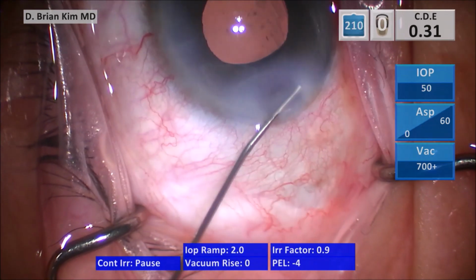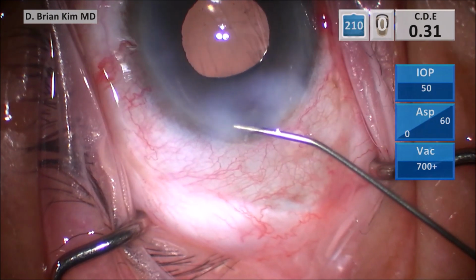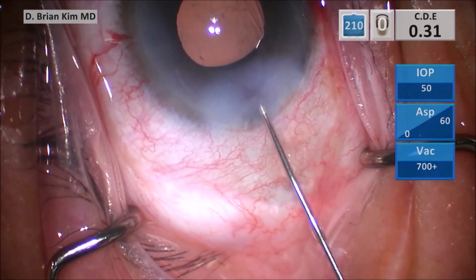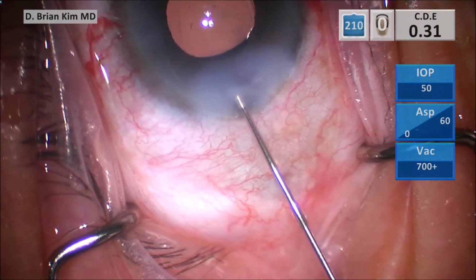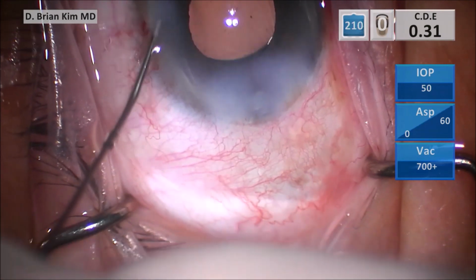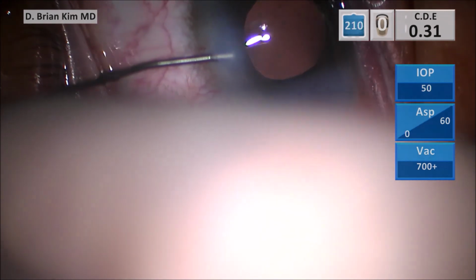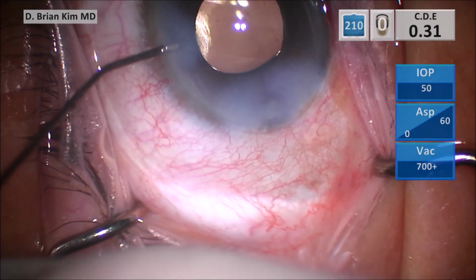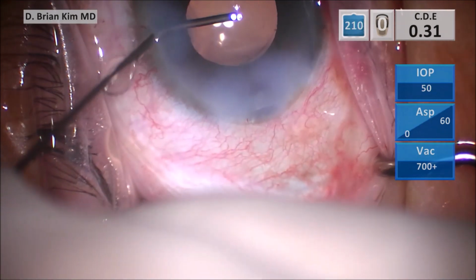So again, this is a small pupil. I'm making sure always that I'm under the epinuclear material every time I place the chopper out to the equator. By doing so, you're never outside of the capsular bag, and you won't traumatize the capsular bag or the zonules. And you can see, as proof of my technique, in these cases, when they're not hypermature, I almost always have an epinuclear shell, and that is proof that I'm, again, within the capsular bag, within the epinuclear shell, crushing and removing the lenses with mechanical fracturing forces.